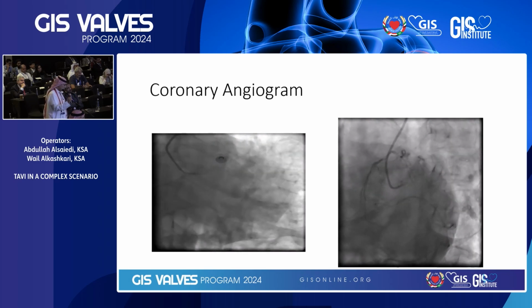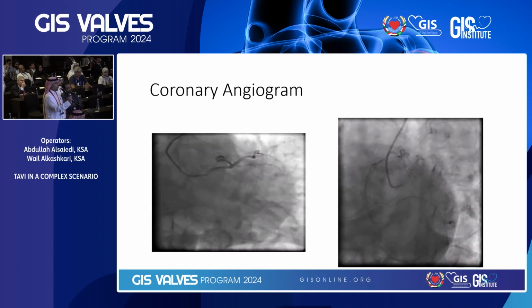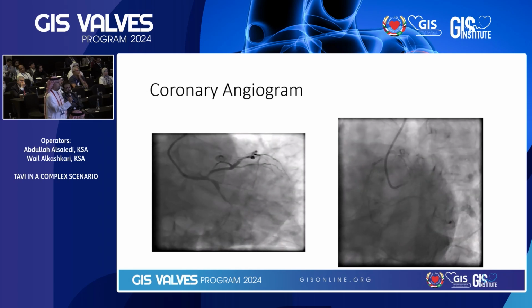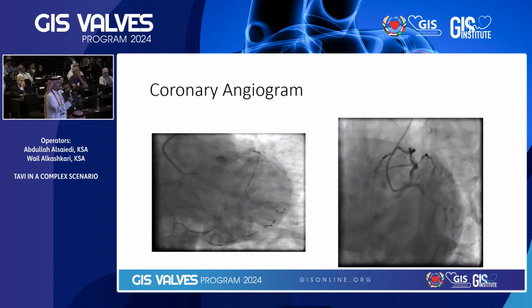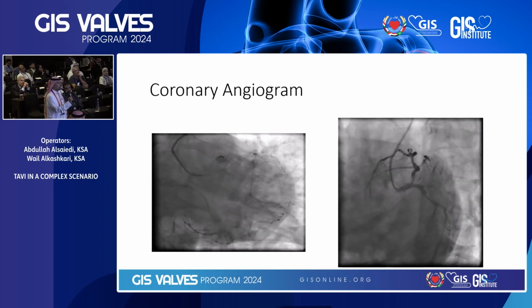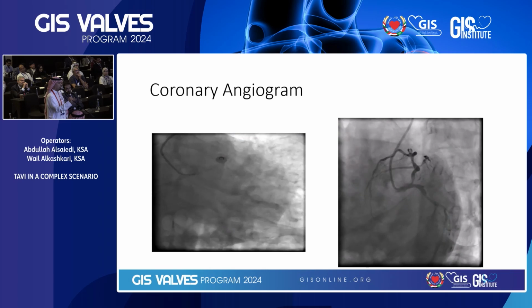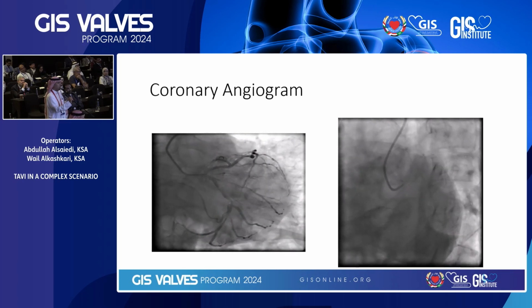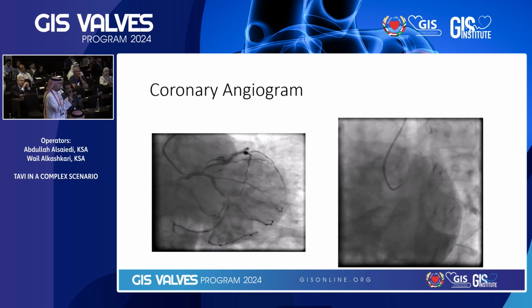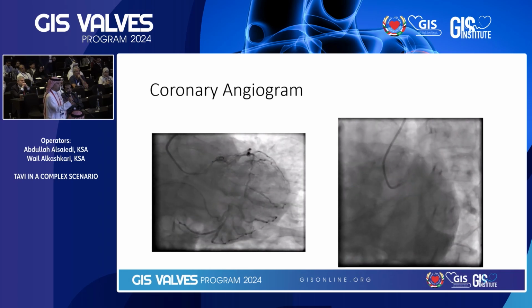Sure. The echo, Abdullah showed you, there is no regionality. But the troponin was 4,000. That's a trap. Yeah, because I don't believe in hemodynamic assessment and FFR, iFR in non-STEMI. So I will probably do, if there is imaging, contrast-based imaging like OCT, to find out if there is a plaque rupture, which denotes the culprit, and I will fix it.